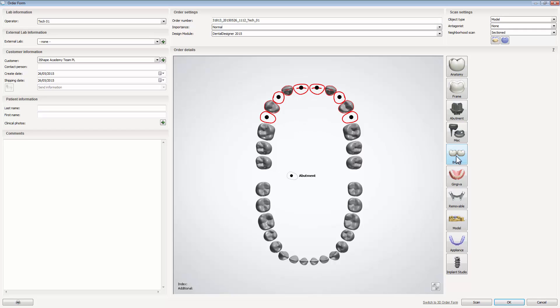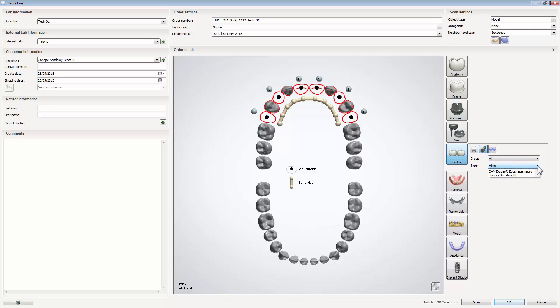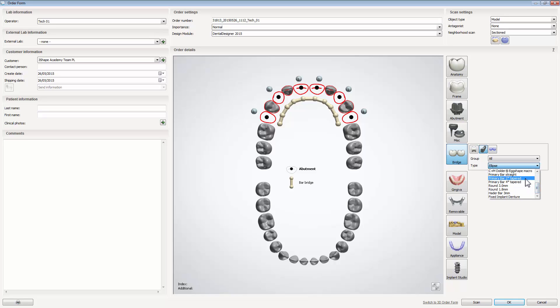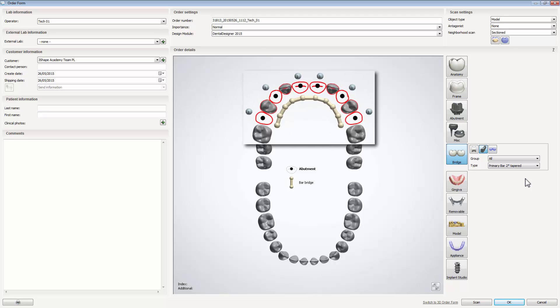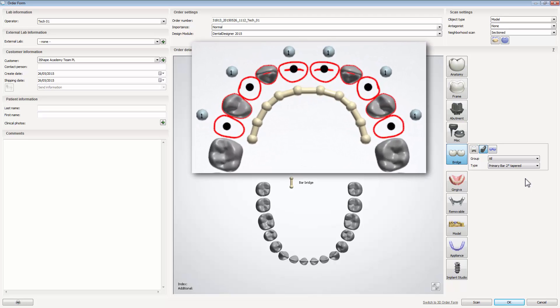Then choose a bar bridge to connect the abutment teeth. From the drop-down list, select the type of bar you would like to use. Remember that you can also do this during the design stage. In the implant bar bridge option, all abutments are grouped and have one insertion line for the restoration.